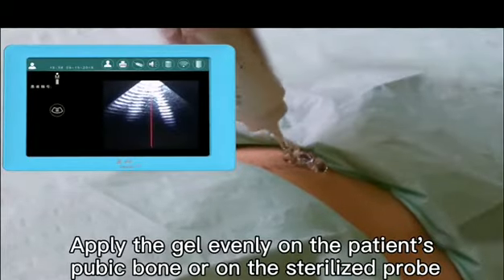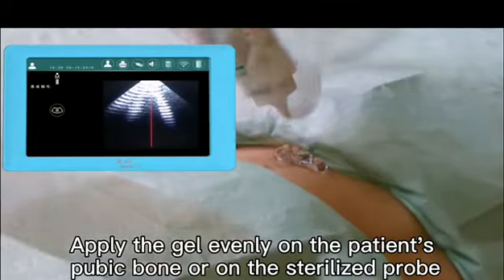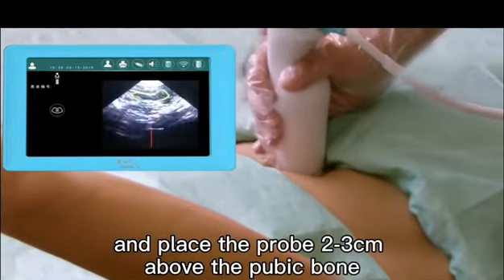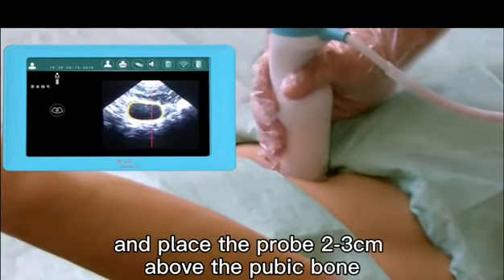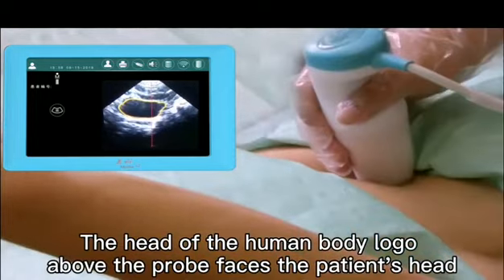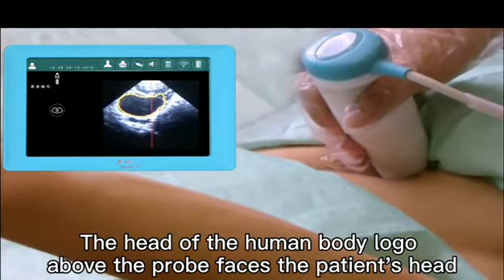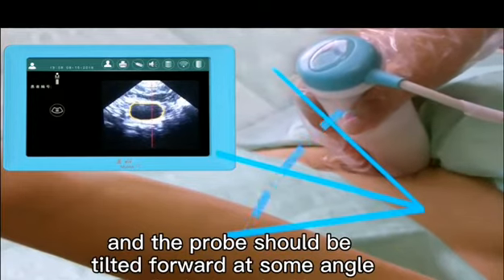Apply the gel evenly on the patient's pubic bone or on the sterilized probe, and place the probe 2 to 3 centimeters above the pubic bone. The head of the human body logo above the probe faces the patient's head, and the probe should be tilted forward at some angle.